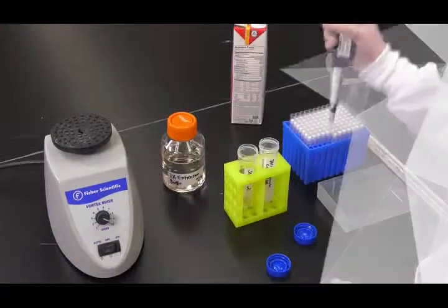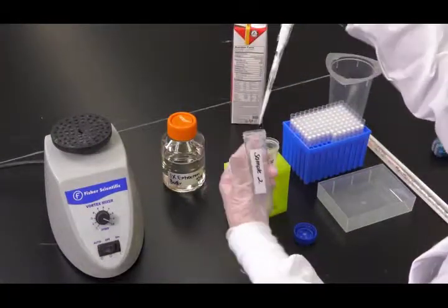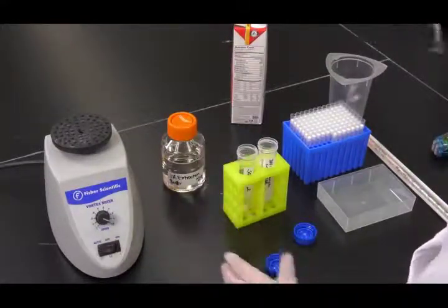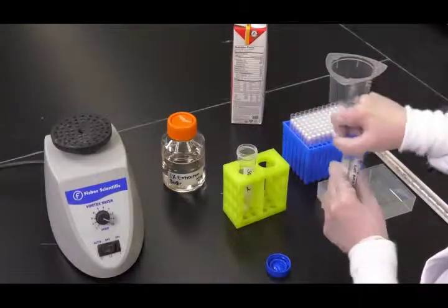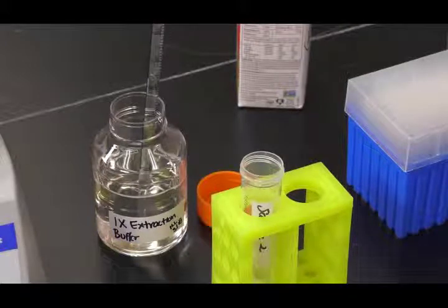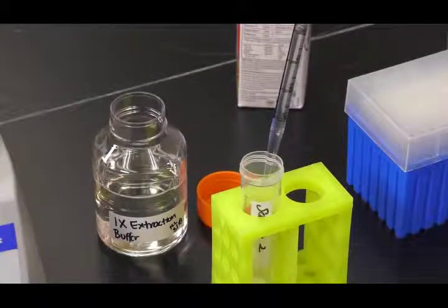For liquid foods or clean-in-place CIP final rinse water, use a sample size of 0.5 milliliters plus or minus 0.01 milliliters. And dilute with 4.5 milliliters of pre-warmed 3M extraction buffer and mix thoroughly.